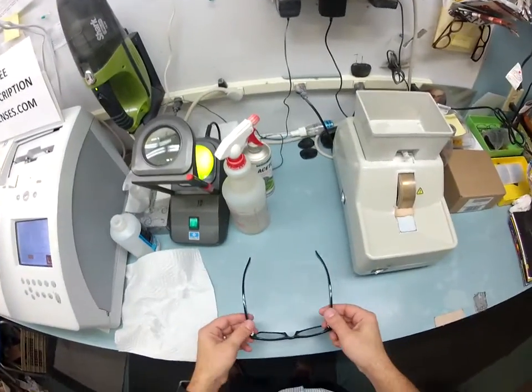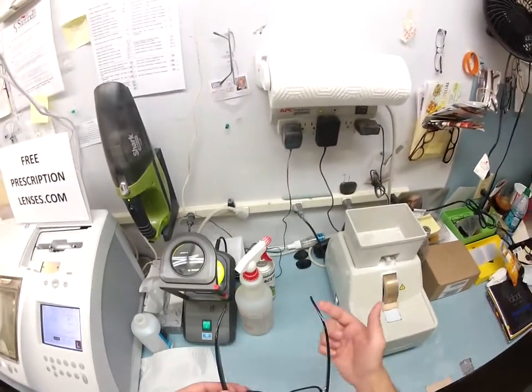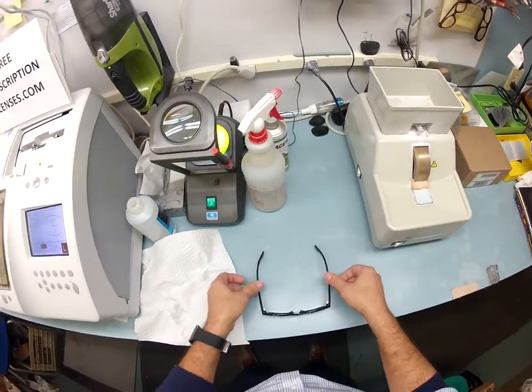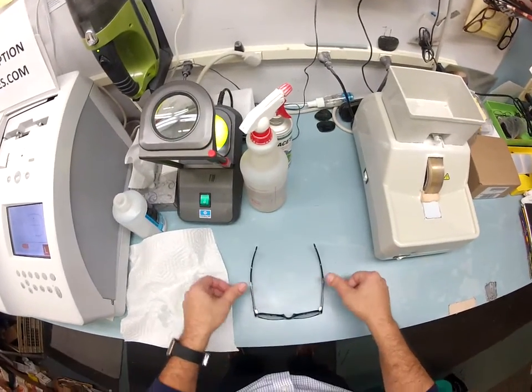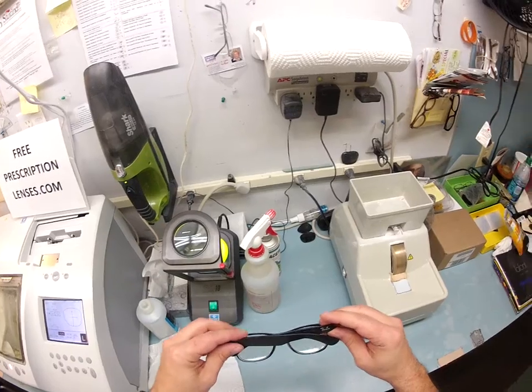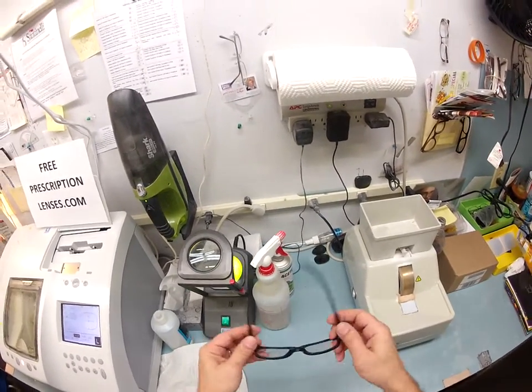I'm going to get it in standard alignment. Where when I set it down on the table, it should have a three-point stance. Those three points are one, two, and the bottom of the frame being three. I put it there — there is no wobble. I flip it over, do the same thing, push down — there is no wobble. I make sure that each temple overlaps each other perfectly, with the same amount of tension on each side.